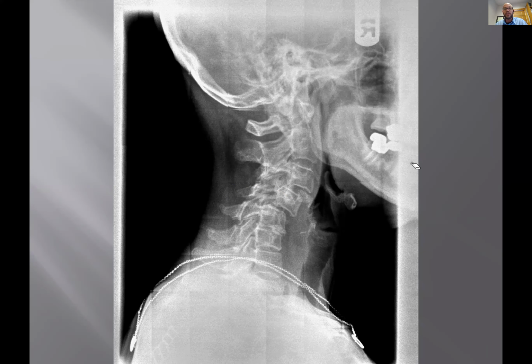All right, questions on this case? Interesting case, right? It is. Just saying, if my patient, I took that lateral and saw that picture, I'd need a fresh pair of shorts. Yeah, I'm with you. I had a case of rheumatoid where the vertebral body was right here. It was a bilateral facet subluxation from rheumatoid. The older lady walked right into the chiro clinic, and that's the only time it was diagnosed. It was insane. And this was nearly as bad.